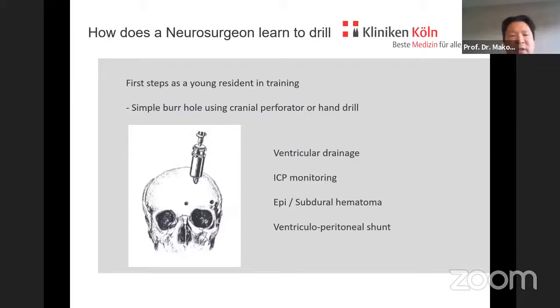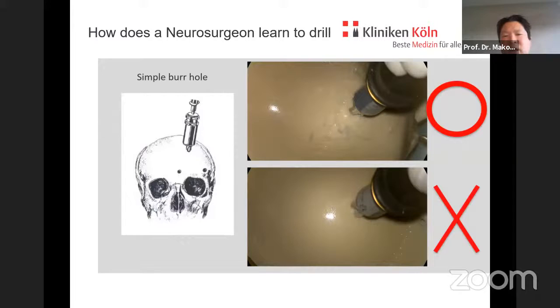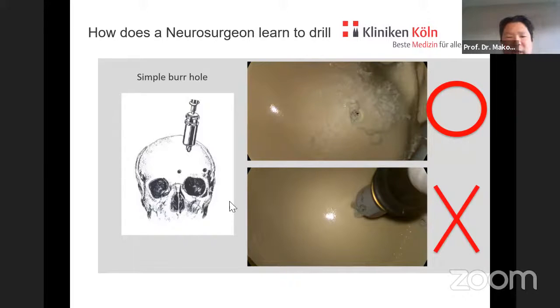Even though it is a quite straightforward instrument, it is really a nice device where the automatic releasing system will in almost every case enable the preservation of the dura. The handling should be learned. So this is the proper handling, just putting in the perforator perpendicular to the bone and not making any rounding movements. Just keep it fixed and put on pressure until it stops automatically.